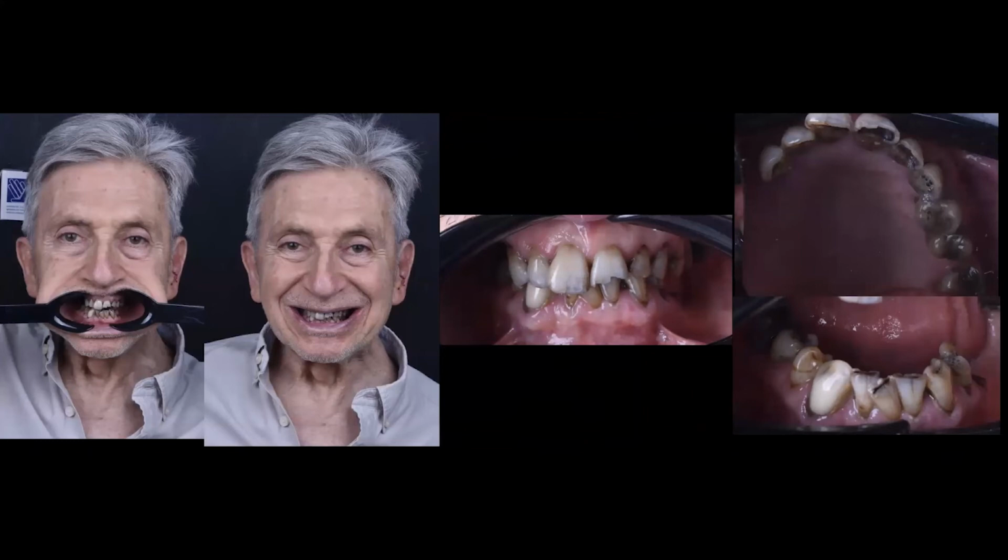It is the most important thing in this day with our work, and with these tools it is so easy. It's easy for the patient to find the solution.